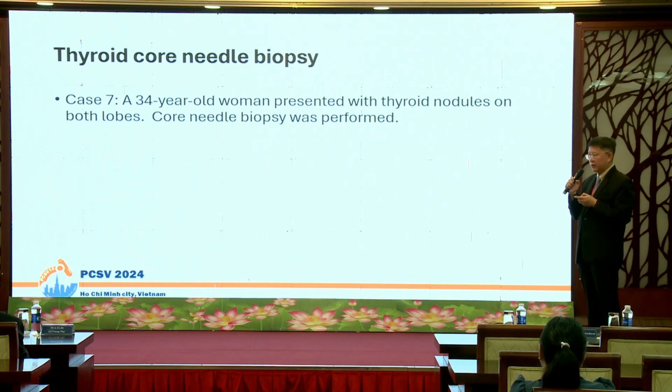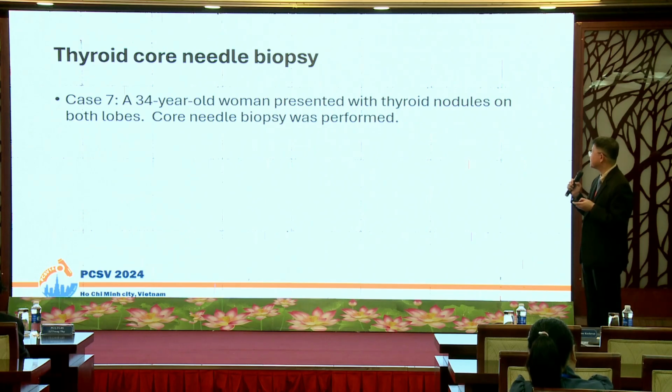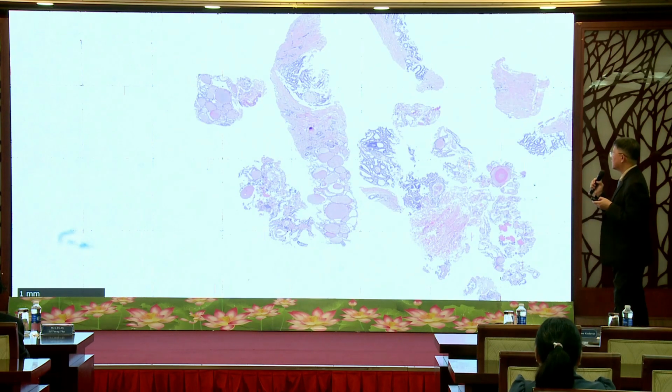Recently, I received core biopsies of thyroid gland very often, and luckily they usually are submitted together with the FNA cytology, so I can compare the cytology and histology slides. That gave me an advantage in interpretation of these cases. So this is a core biopsy of thyroid gland.